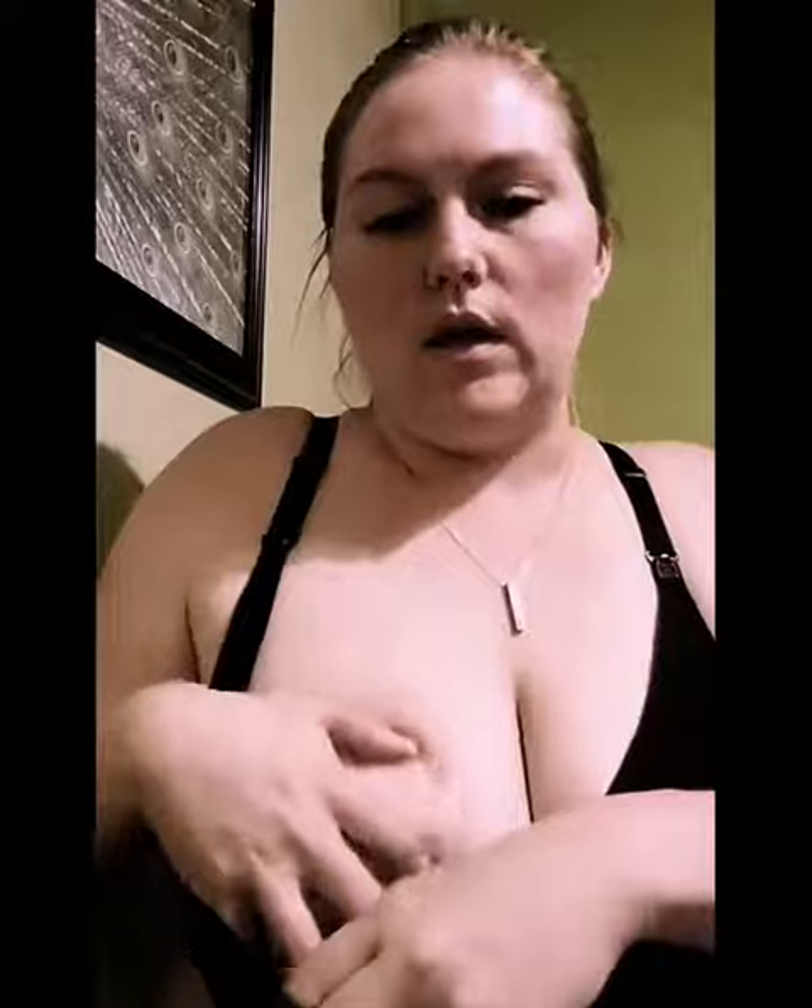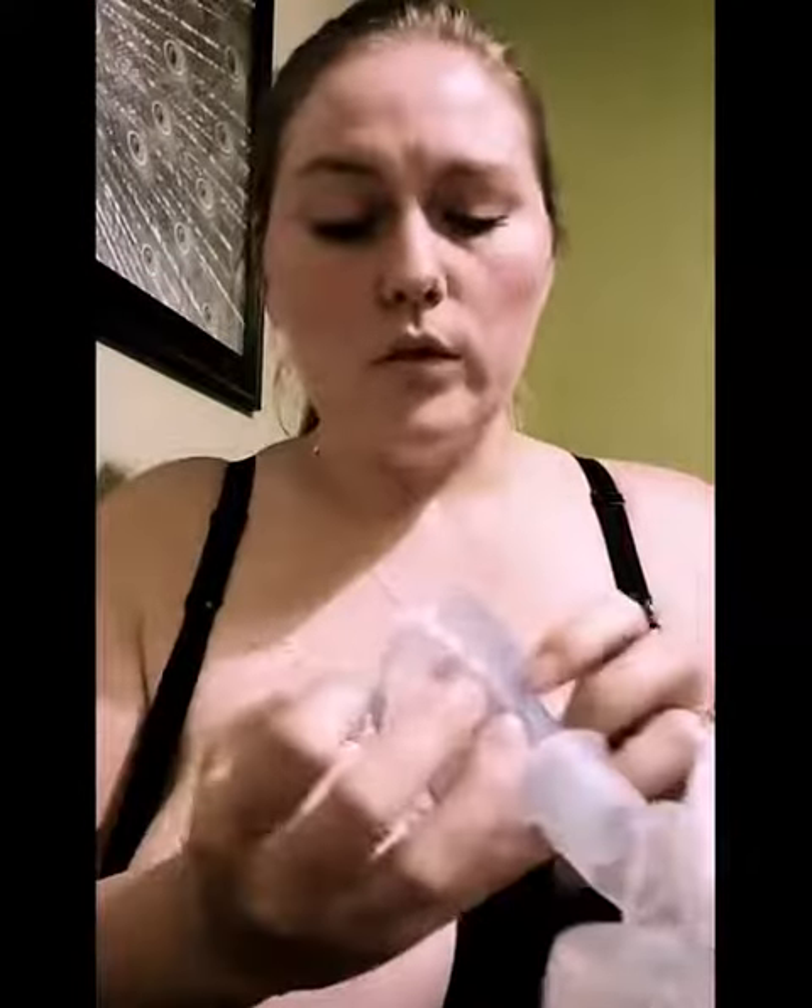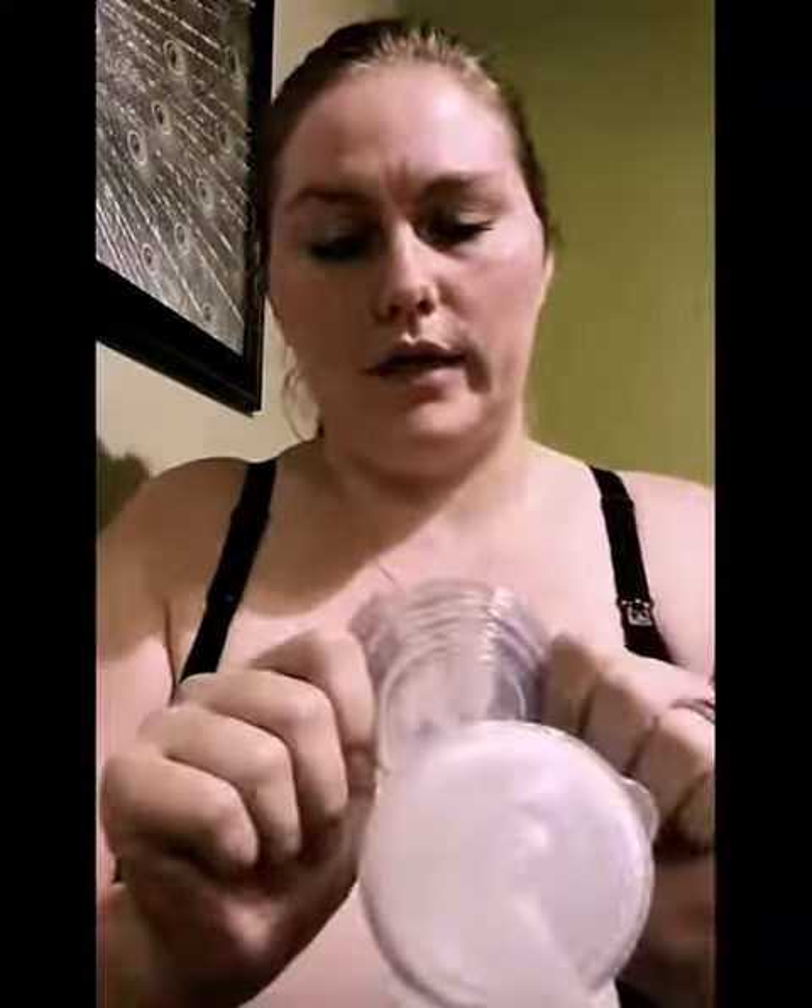Have your breasts ready. You don't want to use lubricant with these because the silicone is designed to grip the skin better, and the lubricant defeats that purpose. So what you want to do is go ahead and take your two hands like this.